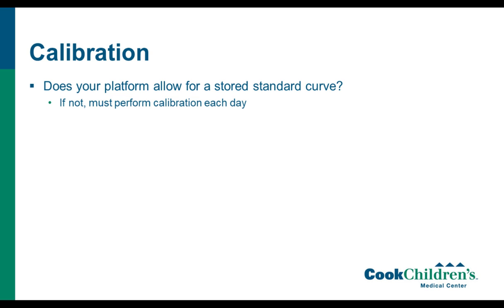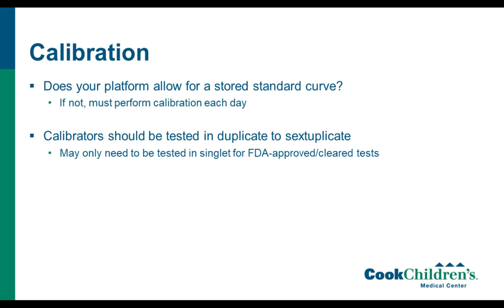So now that you have materials picked out, you want to know, does your platform allow for a stored standard curve? Can you put together a calibration curve and then store it and continually use it each day? Some instrument platforms require you to perform a calibration each day, and then you'll need to create a new standard curve each day of testing.